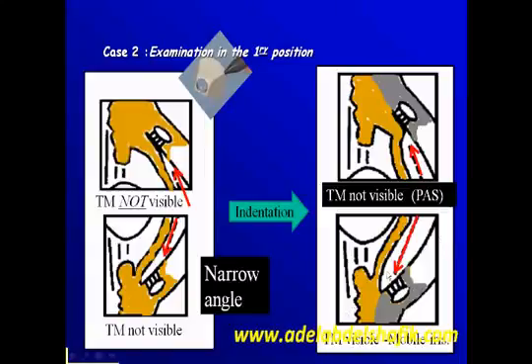In the lower part, when we do the indentation, you notice one more thing here. This is the most peripheral part of the iris. It was pushed behind. The iris is movable. In this drawing, the iris is pushed forward. With the indentation, the iris was pushed backward. This is an important sign in cases of plateau iris. If there is a plateau iris, the ciliary processes are behind and you cannot do that. But if it's just a pupillary block glaucoma, then you can push the iris back.